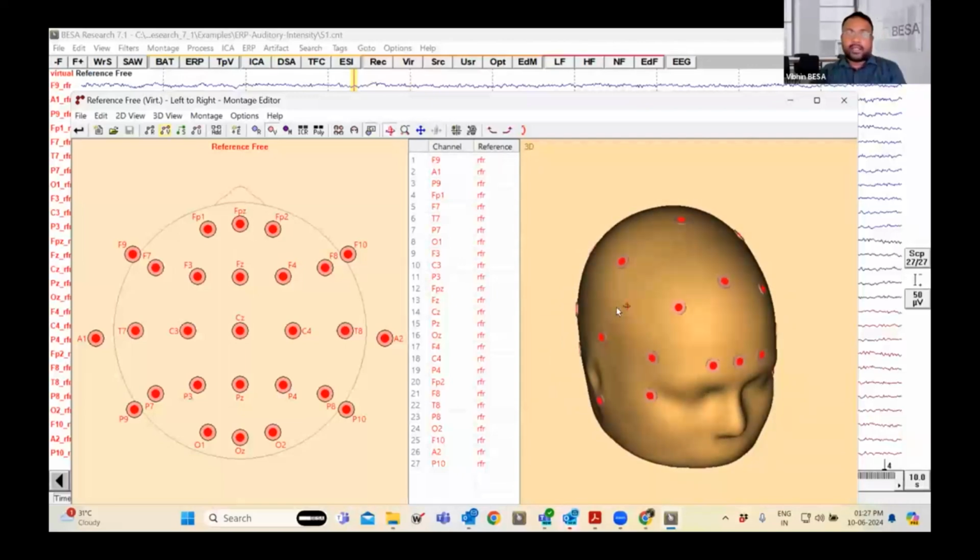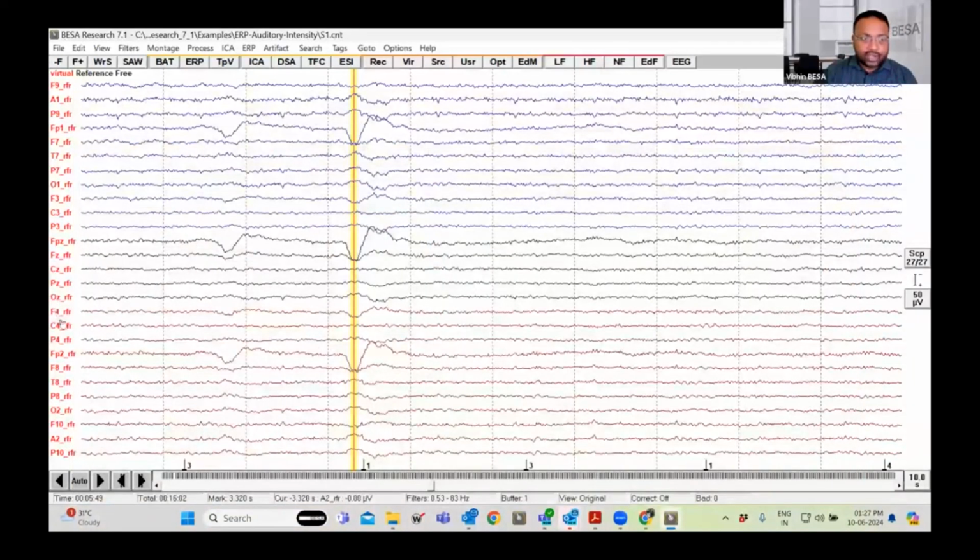Now, what happens with this montage is that you can see one important factor, which is the CZ channel, which we saw earlier to be flat, is not flat anymore. It shows some small activity there. Earlier it was flat because all channels were referenced to CZ. But with this virtual reference-free montage, we see that at CZ there is some activity going on.